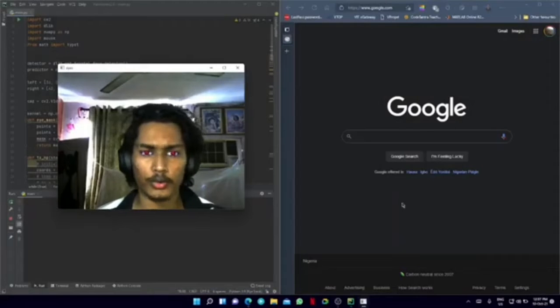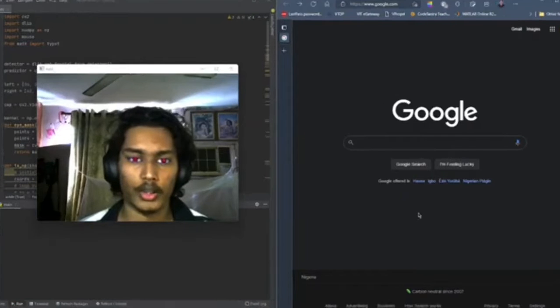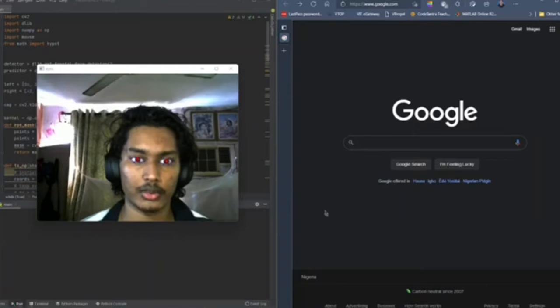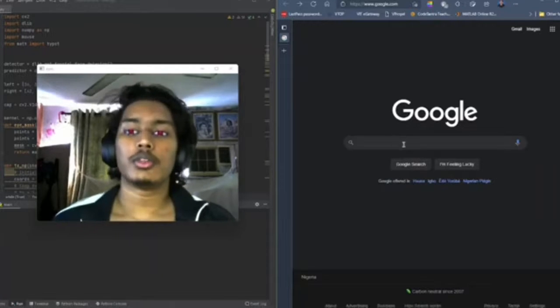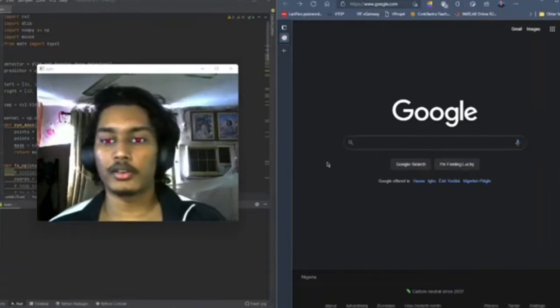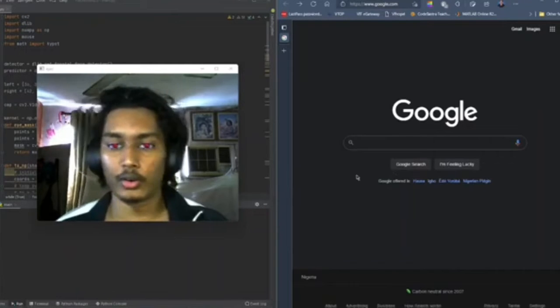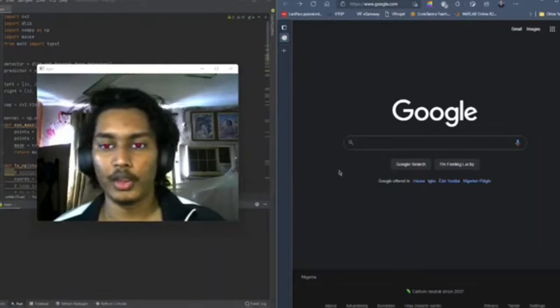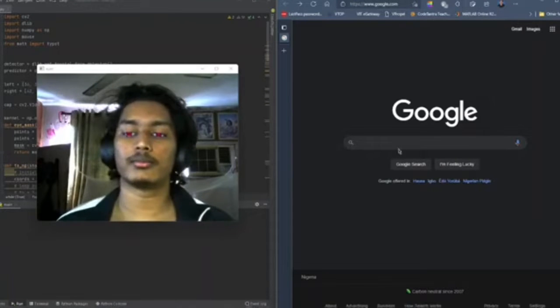Good morning. Today we will be doing the project demonstration for the project submitted to our hackathon. As you can see, our eyes are getting detected in the eye tracking monitor. The blue outline shows your eyes, while the red outline scans for your iris. Now, if we move our head around, it tracks our eyes according to the relative position and moves the cursor also, as you can see. Now if I move and do a right click, it will perform a right click, a left click, sorry.